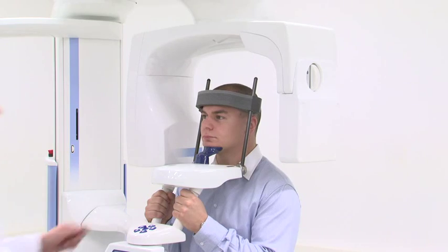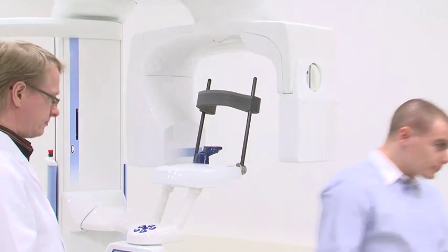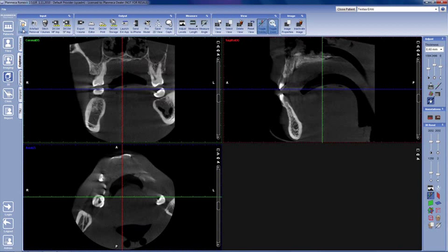Once the arm stops moving, help the patient out from the unit. After a few moments, the image has been reconstructed and it can be seen in the Romexis Explorer.